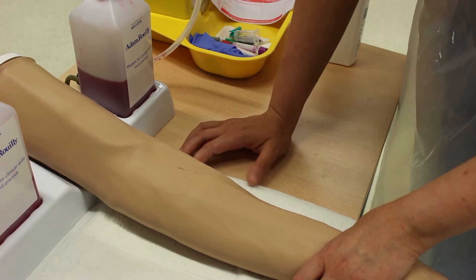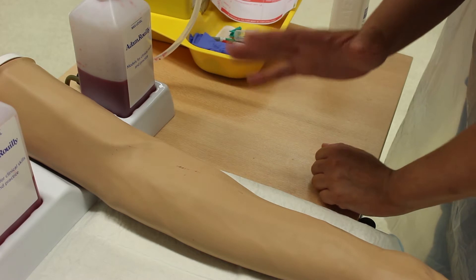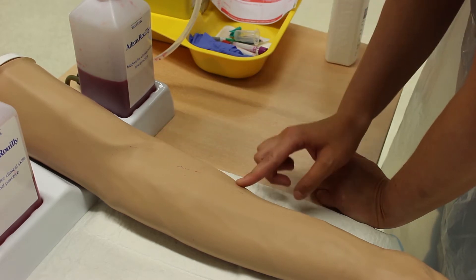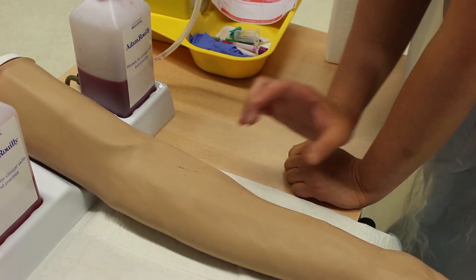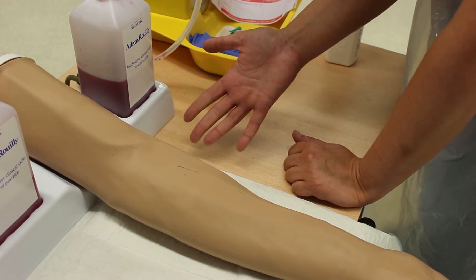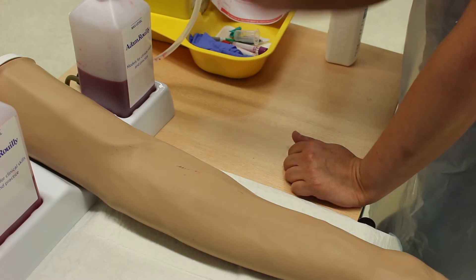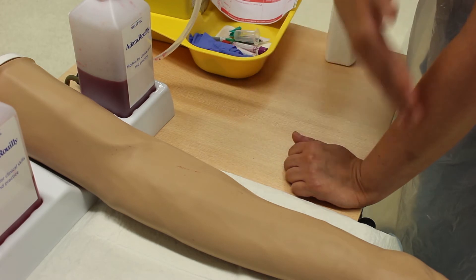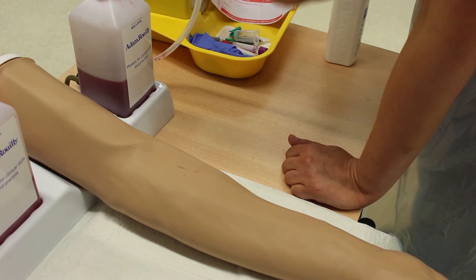The veins you feel, not see, are the best to go for. Avoid veins that are hard, knotty, or sclerosed; avoid uneven veins where the journey isn't straight; avoid veins if IV fluids are running in that arm; and avoid veins where there's bruising, swelling, or signs of phlebitis. Never use veins in arms with AV fistulas, lymphedema, post-breast cancer or mastectomy, fractures, or for stroke patients.